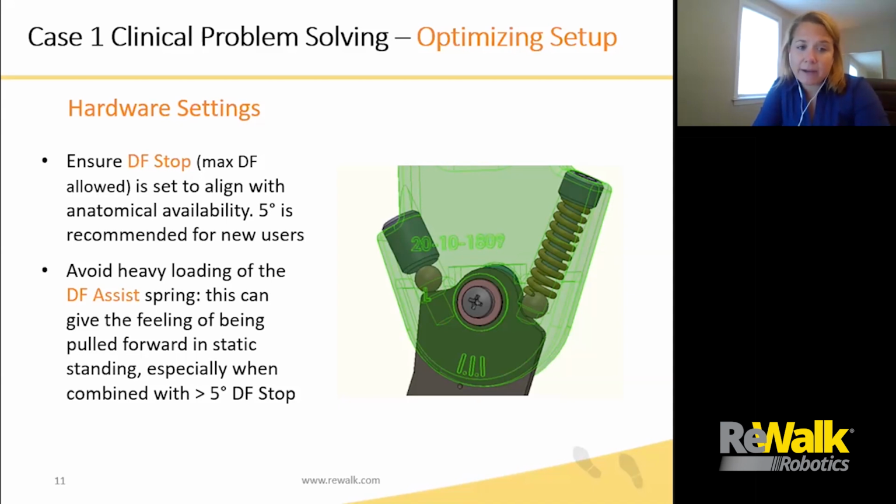So definitely circle back to that as they get going, because the more anatomic position we can get them in, which obviously is some dorsiflexion, especially in late stance phase, the better. So as they progress, circle back to this and sort of bring them down into more dorsiflexion. But early on, open them up, and that can surprisingly help a lot with their standing balance.